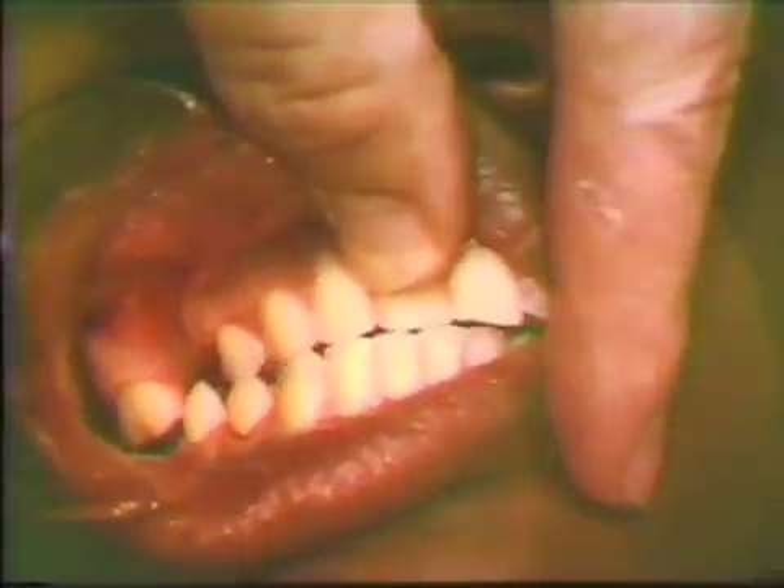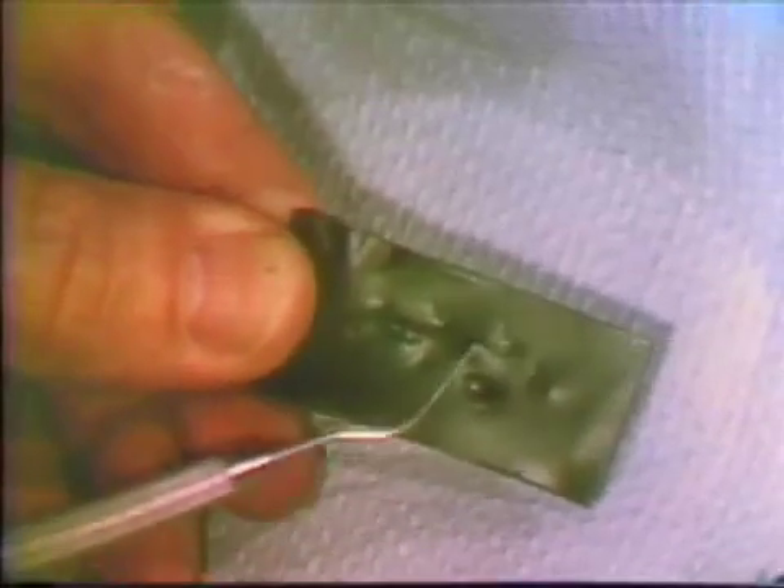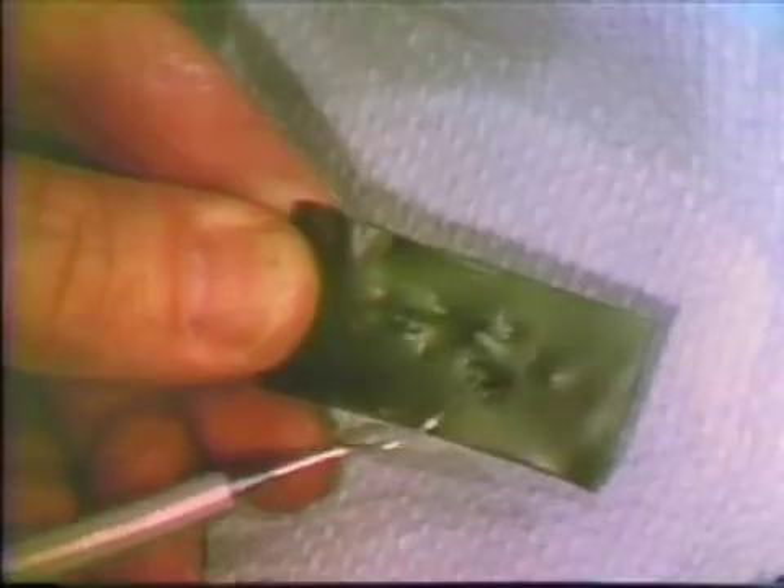Lateral excursions must be checked to assure clearance in that dimension. A double thickness of number 28 gauge green wax should provide adequate gold thickness for most crown restorations. Perforations in the wax in the area of the abutment teeth would indicate that further crown reduction is necessary.